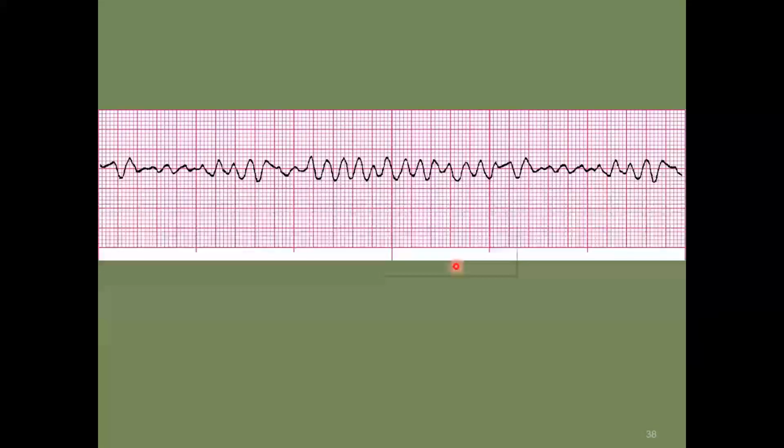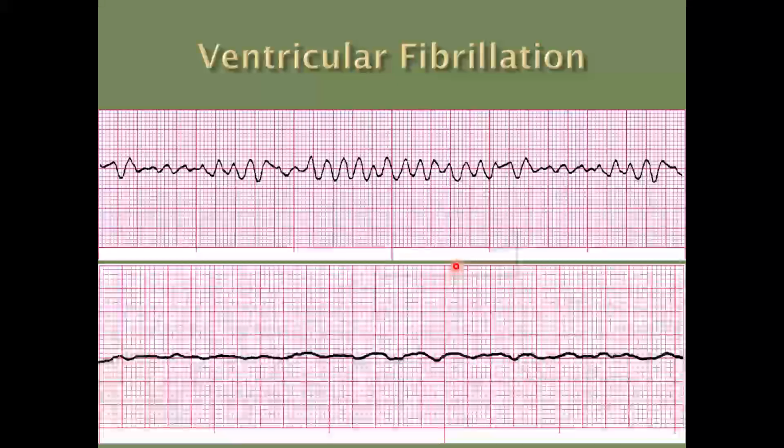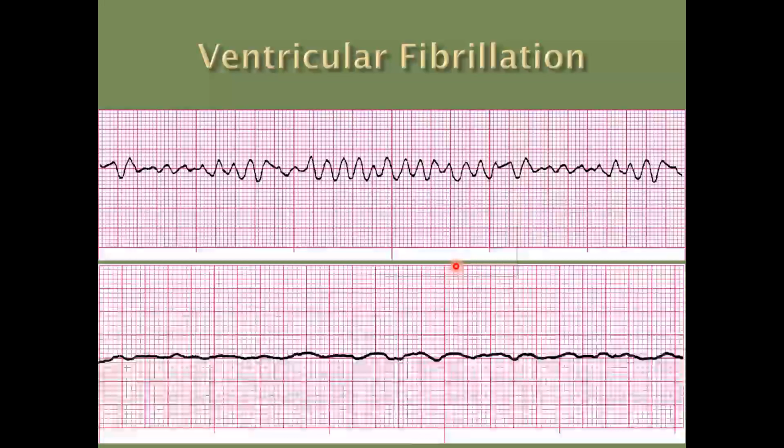All right. So, you've always heard the thing, if in VFib, DFib. Yep. Check a pulse. All right. Because if this person has a pulse with this rhythm, then I check the leads. All right. So good job there. Ventricular fibrillation. We're going to defibrillate them. All right. What do you think about this one?